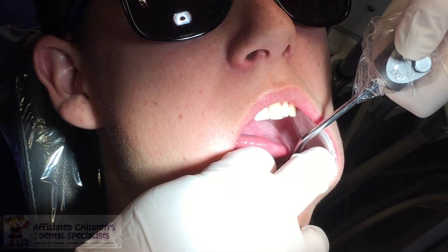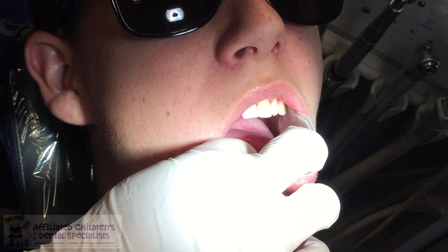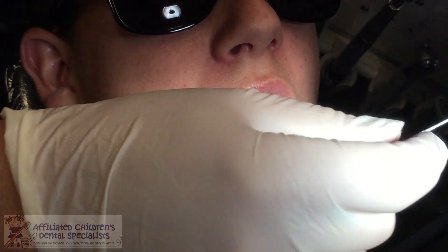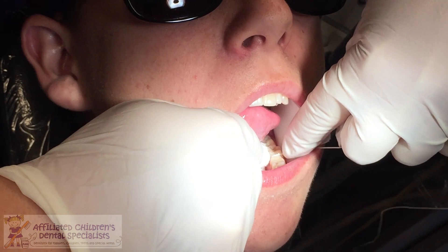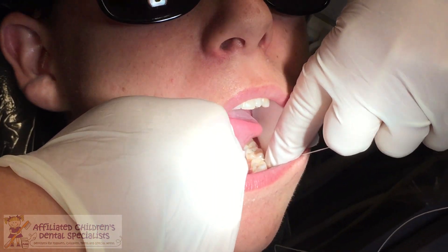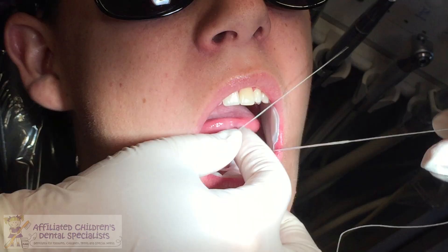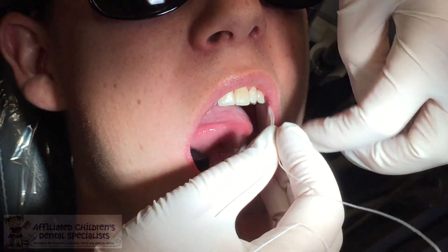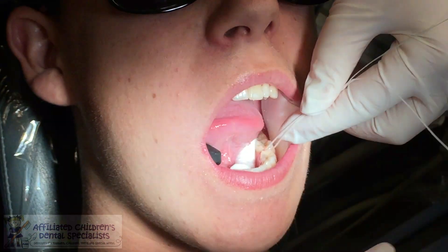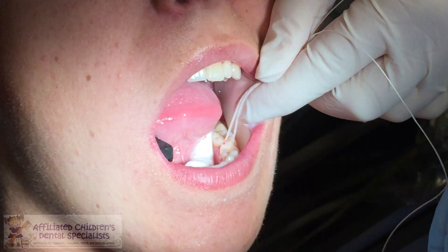So I'm just going to spray a little bit of air. We're just going to put this on the distal of K. I'm going to put some floss between your teeth — this is the super floss. You just place it in between the teeth. You have a nice tight contact, so just leave it there and be careful where it's dangling. We're going to use the new blue, so you're going to see just how far it soaks up into the string, into the floss.